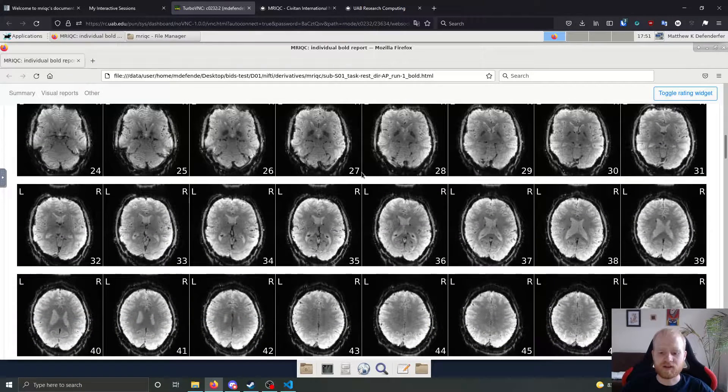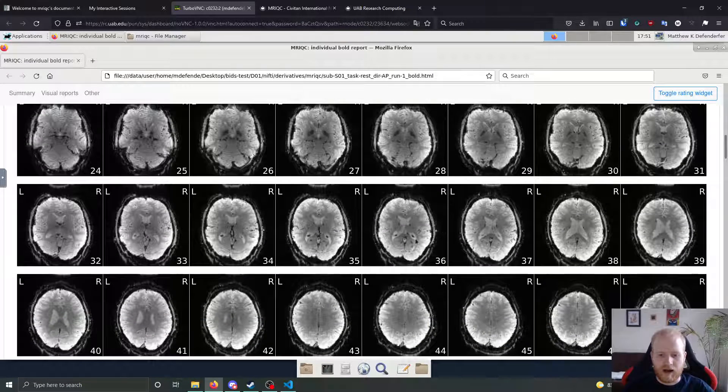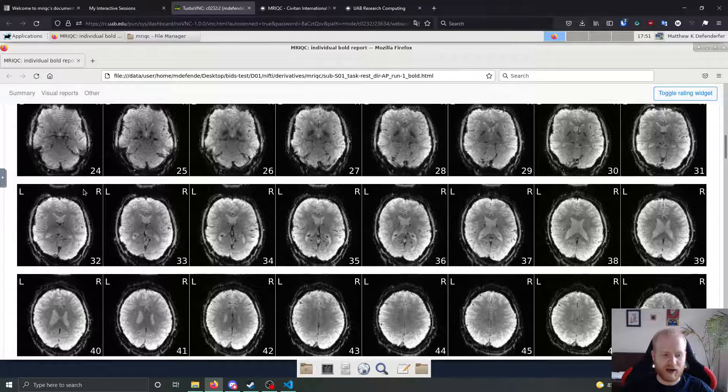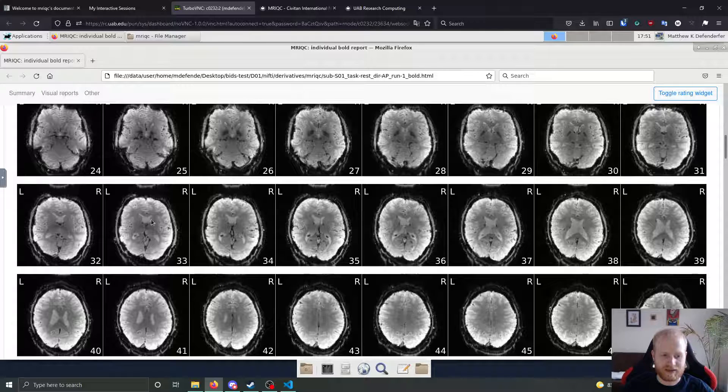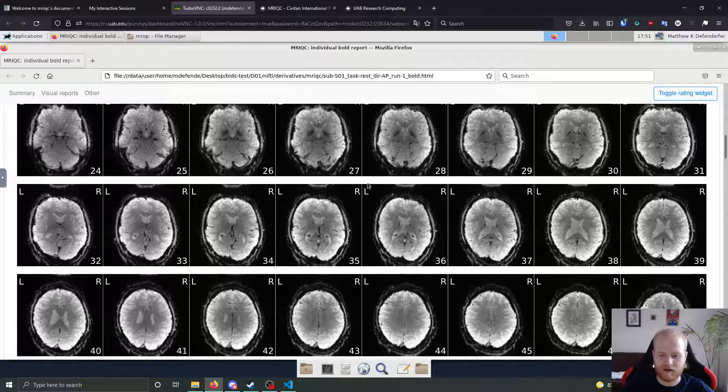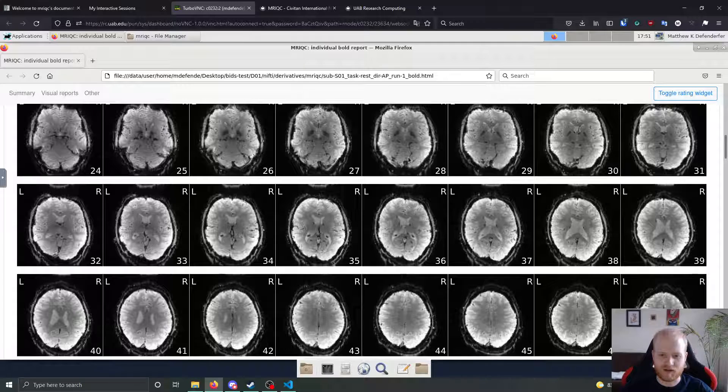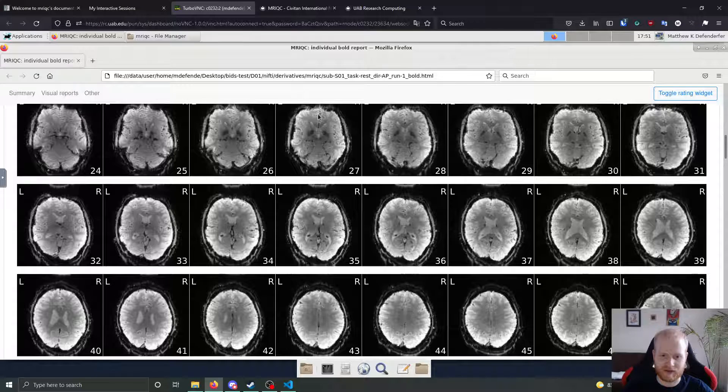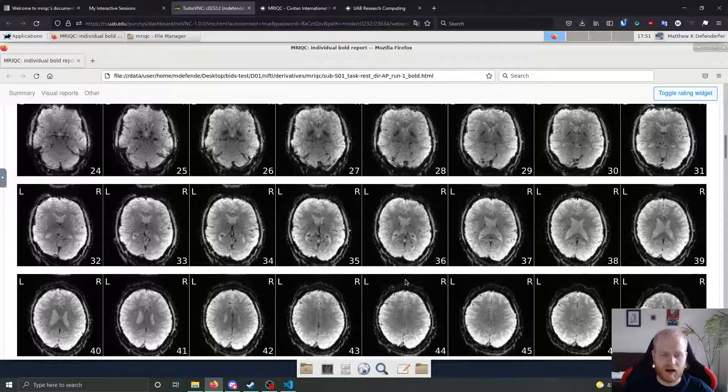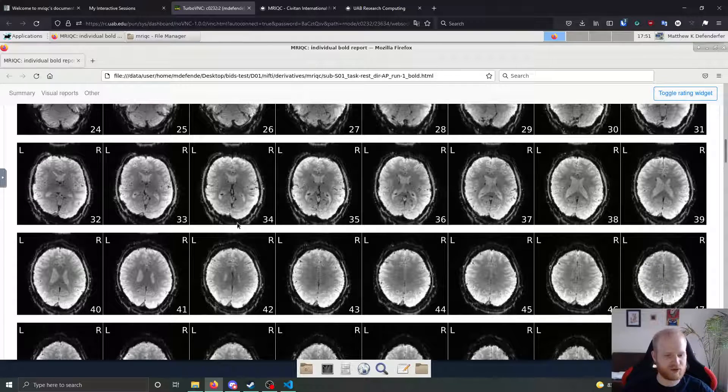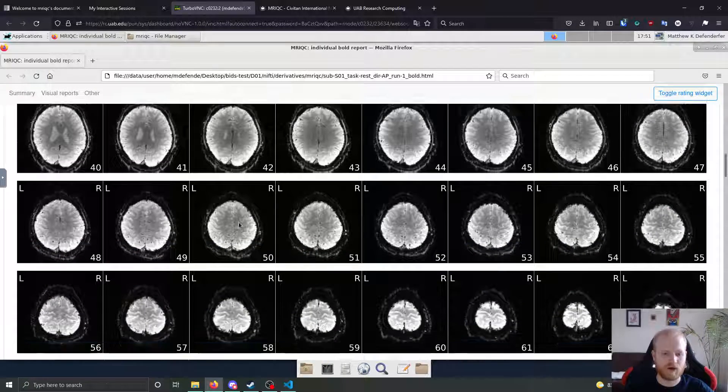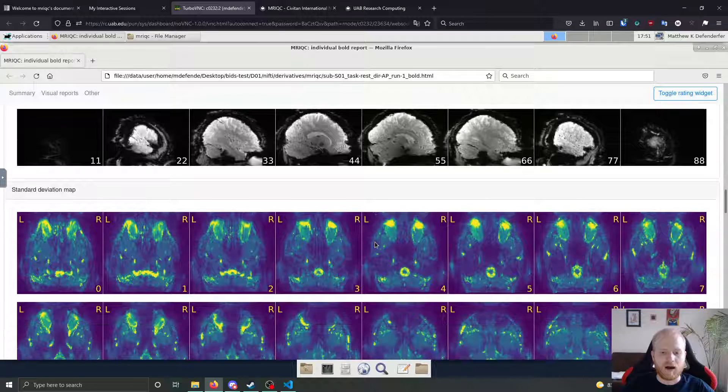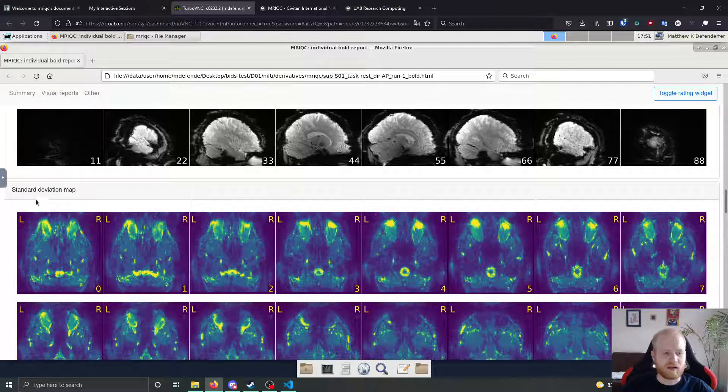So you can look through here, in the main area of the brain, you can see pretty high contrast between white matter, gray matter. And overall there is a little bit of, there is a tiny bit of motion artifact that you can see through some of the ringing at the front. But in most of these slices, everything looks pretty good overall.